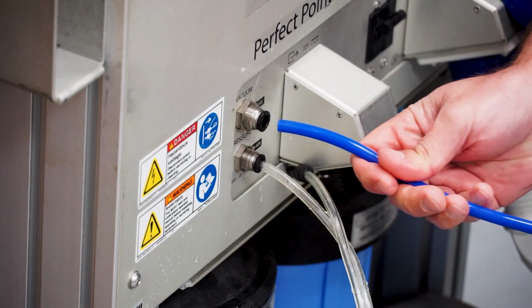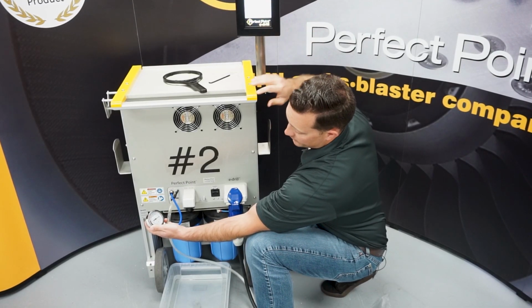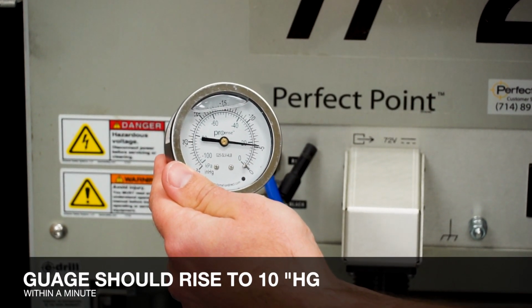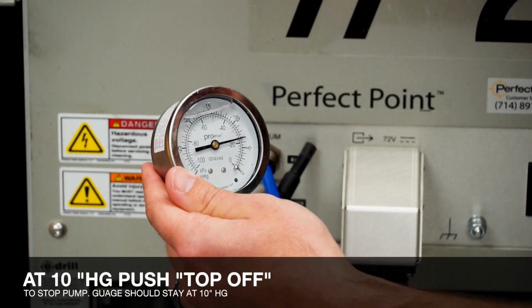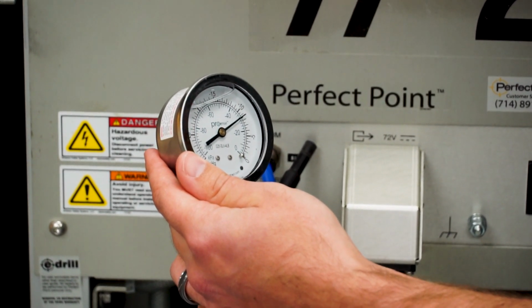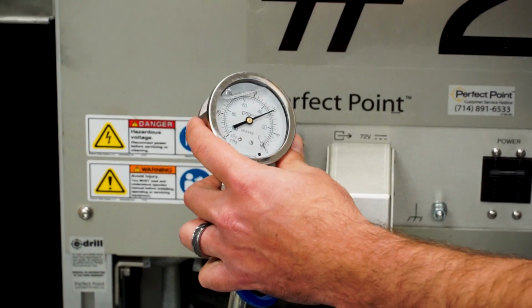Install our vacuum tube into the vacuum port, run system top off, and witness our vacuum gauge rise to 10 inches of mercury within a minute. Then after it gets to 10 inches of mercury, we're gonna push the top off button again to stop the pump, and the needle should stay right where it stopped. If it doesn't, you've got a system leak. Again, check that O-ring you just changed.